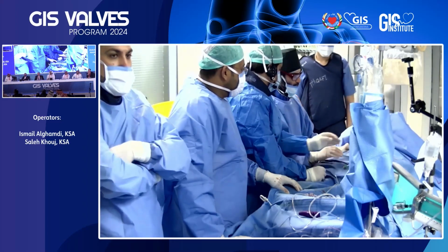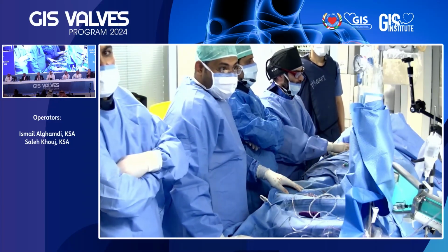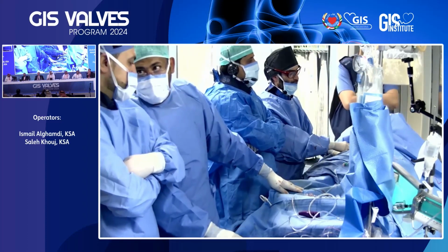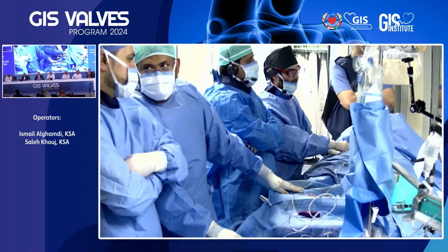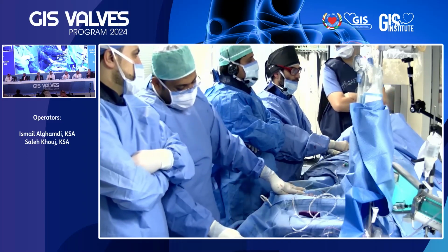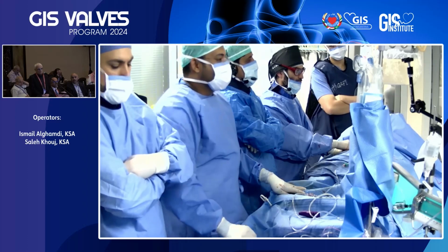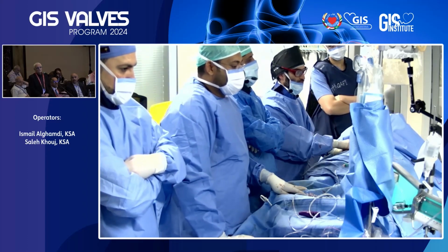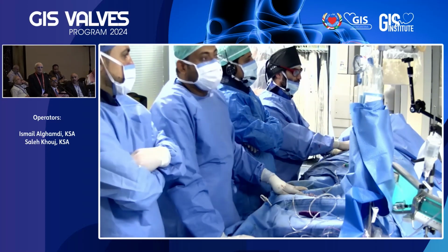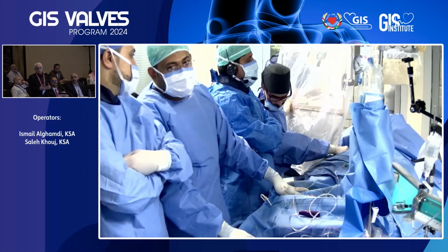The second thing that is very, very important when you size the balloon and when you do the final shot is whether you have an infold, which happens with the oversized valve. An infold in bicuspid is unfortunately a little bit more frequent than in regular aortic stenosis, but a 34 in this one I think would have been not a good choice. You could even argue, I don't want to downsize too much, I understand that, but that question could be resolved with an injection in the 20 millimeter balloon, because with the 20 millimeter balloon, you don't do much.